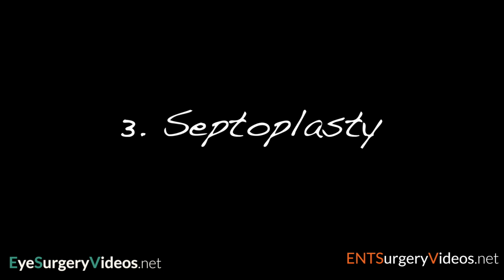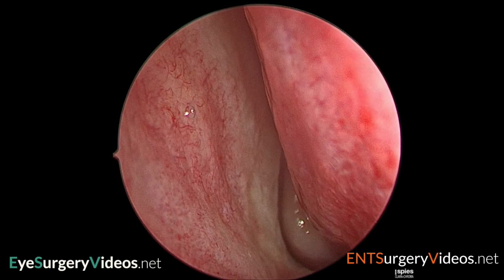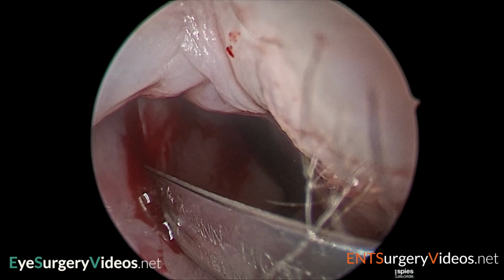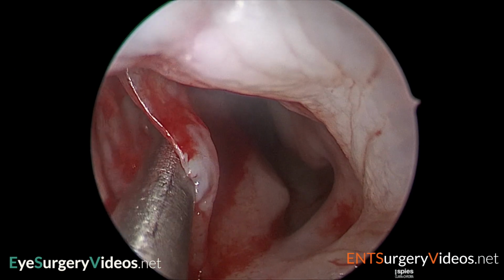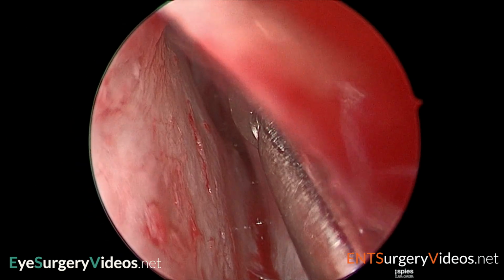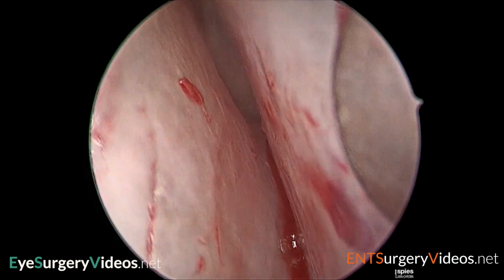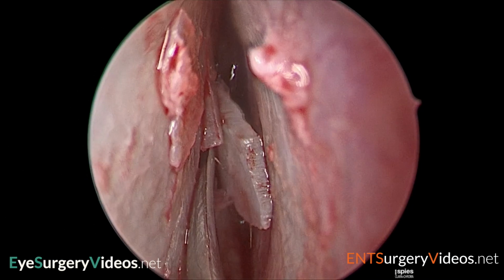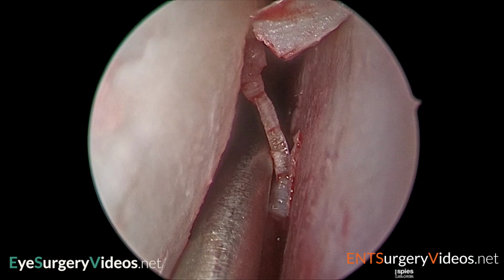If gentle instrumentation of the nasal septum is inadequate to provide adequate access and prevent repeated abrasion and trauma to the nasal septum and the nasal mucosa outside the area of the incisions, a septoplasty should be undertaken, which will greatly improve access and minimize trauma. Septoplasty surgery is reviewed in detail in another video on this website.